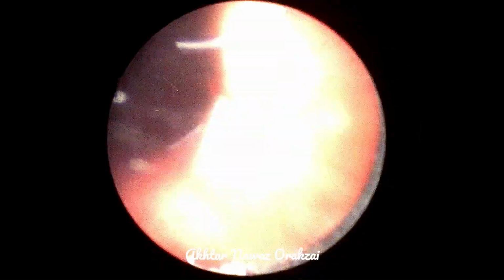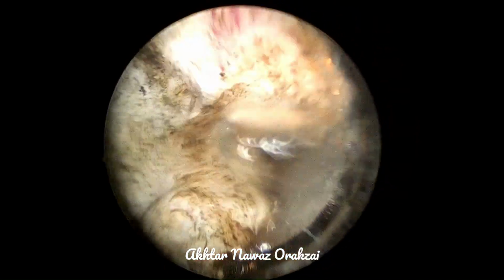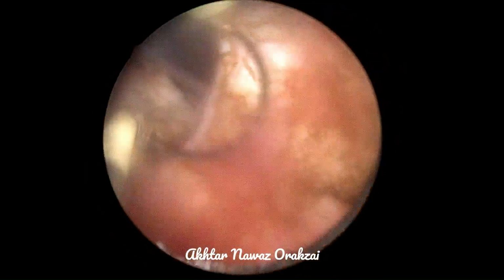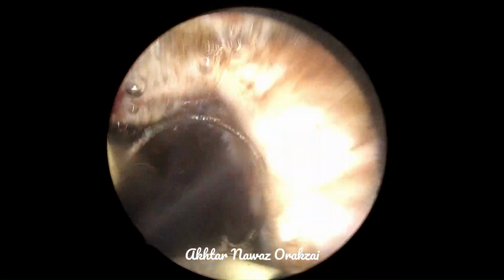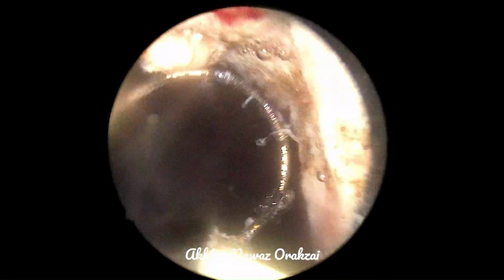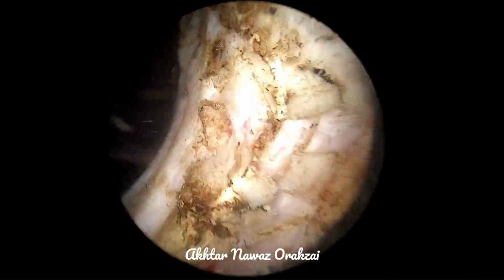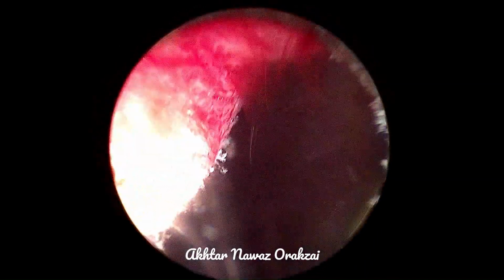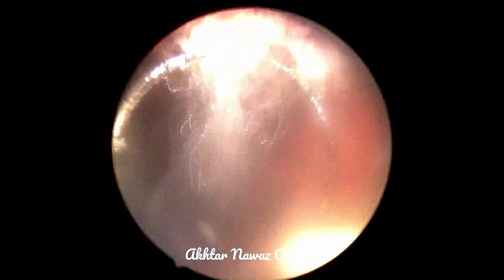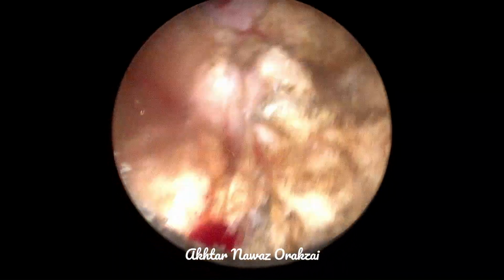The advantage of this is that if you start resecting at the 1 and 2 o'clock position and come downwards, the remaining prostate will fall down upon the verumontanum, and this will make the resection a little difficult, because the area around the verumontanum is the most difficult one to resect for the risk of incontinence.